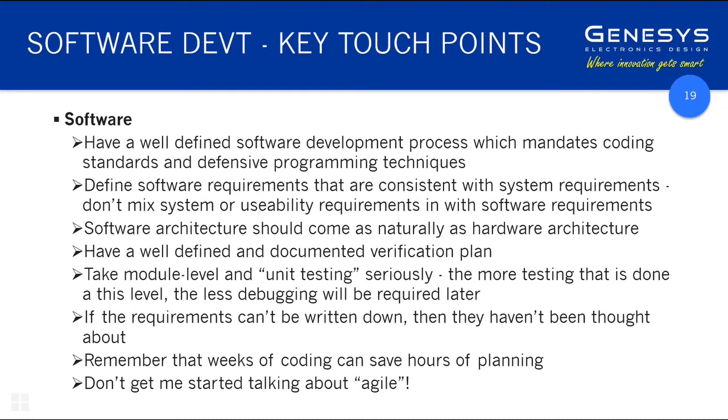So just in case no one's had their coffee this morning, clearly planning is key to save you spending weeks of coding and experimentation. Software engineers love to rip in and start doing application coding work. It's the very first thing they do. We have an in-house gated process for software development with about 20 steps in it, and I think the 18th step is to start writing the application. The application code can be considered probably the least important part of the whole software process.